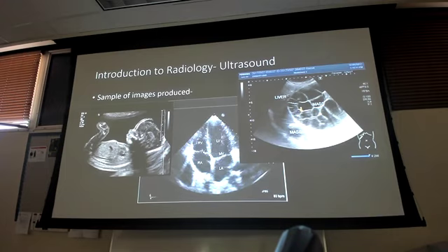It's all based off of where your transducer's at, and that's why I say this is user dependent. So most of your cardiac ultrasounds are subxiphoid. They go up underneath, which means the closest thing to your transducer is your ventricles, and your atria are farther away, which is why this looks flipped and upside down. It's not. It's just because that's where the transducer is at. So that's why I say it's very user dependent.